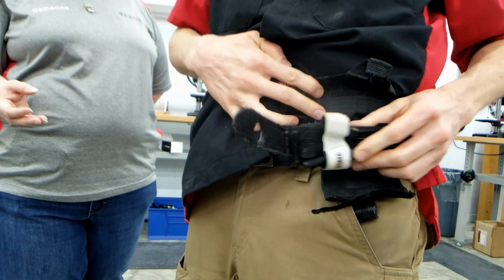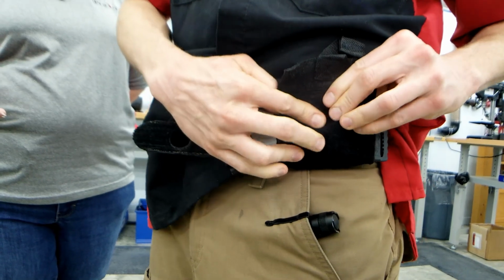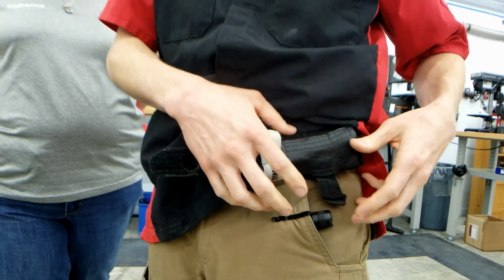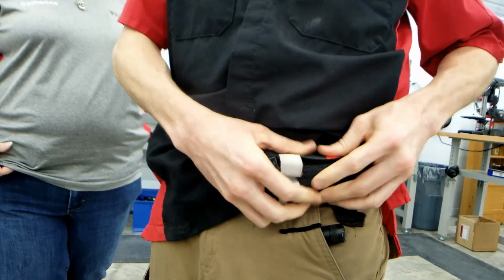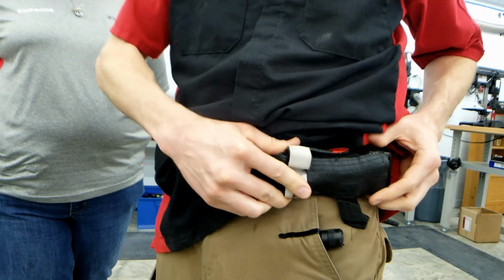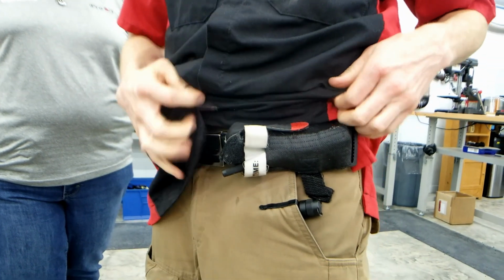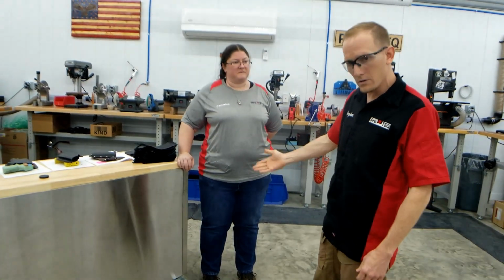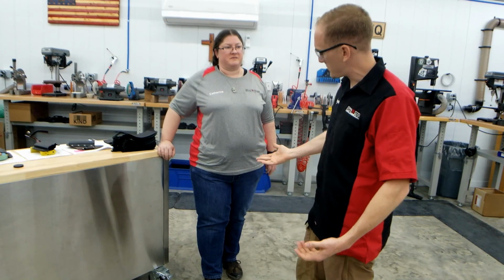I'm going to take the tourniquet, put it in there, tab out, wrap that up, wrap that down. And I like the pull tab to be down against my pocket instead of hanging out here where it could print under my shirt. And then I take this and lay it right up over the top. What that does is it prevents the tourniquet from sliding out the back or out the front, because that Velcro is attaching to the tourniquet holder itself. And then that's how I wear it. So there it is. You can smush it and slide it around on your belt and get it where you want it. And when you're wearing a form-fitting shirt like Miss Catherine is, it really doesn't print too bad. It looks like maybe a cell phone or something under there.